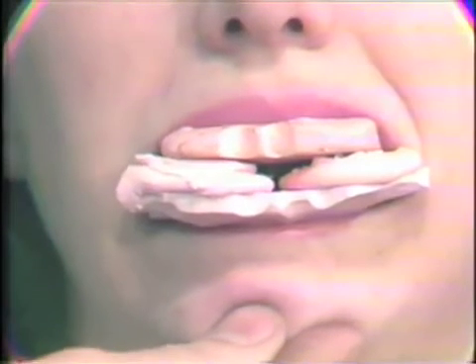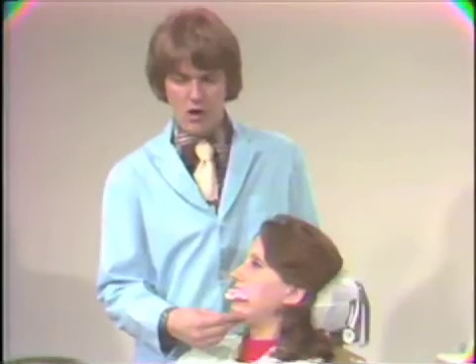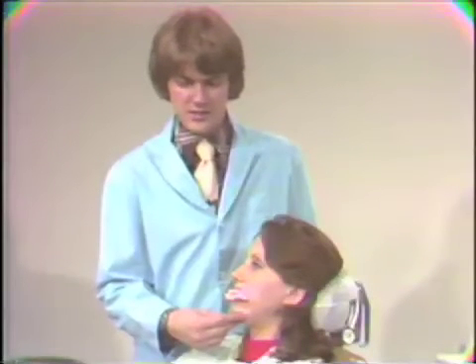Now what we'll use this for is just maintaining our centric relation position that will aid us in mounting the mandibular clutch on the articulator. So once we've made our compound jig, we've completed our second stereographic recording wash, we're now ready to take our face-bow relationship using these clutches, and we're ready to take it to the lab and program our articulator.